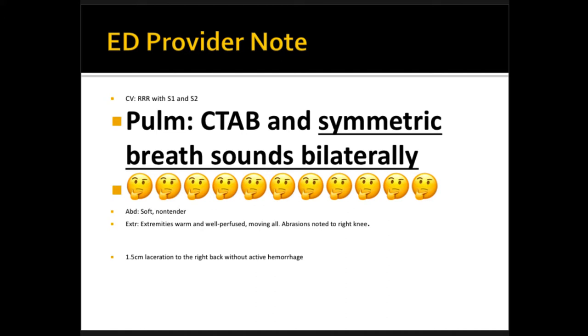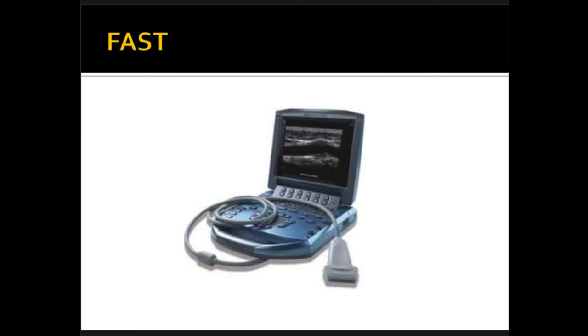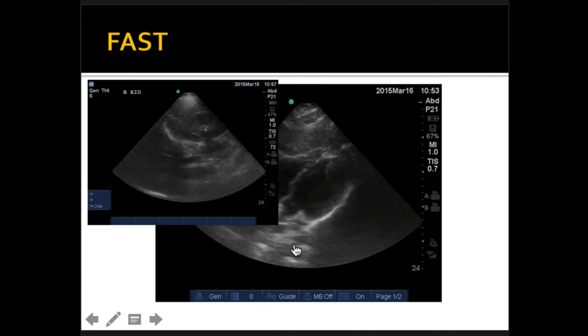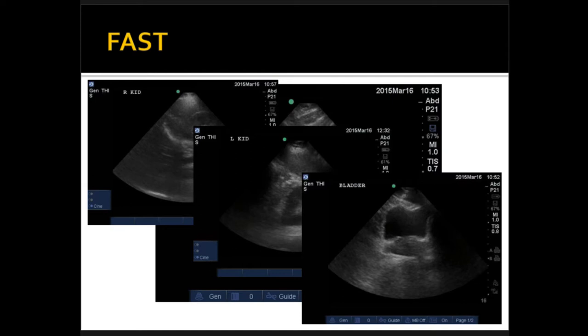What's the first window you want to do in your FAST? Just in case of any penetrating trauma, especially anteriorly in the torso — you do the heart. Look at the heart, it looks great. Then you do Morrison's pouch — no blood. Left kidney, splenorenal junction — no blood. Pouch of Douglas — no blood. You're done with the FAST. What's next? The E-FAST — the extended FAST.